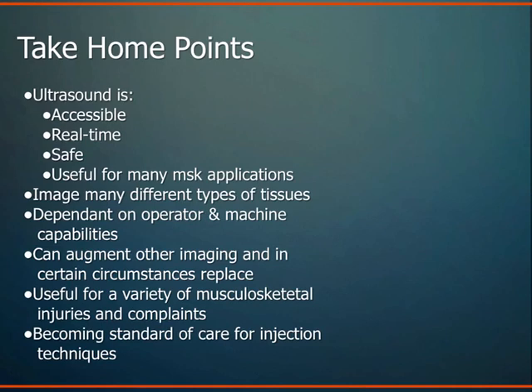And as I mentioned, it's in some cases becoming almost standard of care now to use ultrasound guidance for some of these joint and soft tissue injections we used to do routinely blindly. So lots of applications, a very exciting field, still very much the wild west of ultrasound imaging, but we're learning more and more as we go along, and we're all trying to get better and more adept at using this modality. So that's it. Any questions?